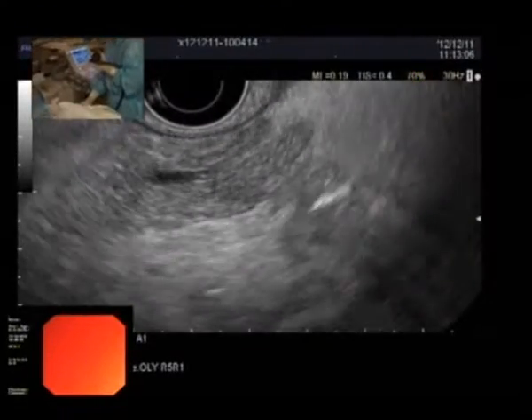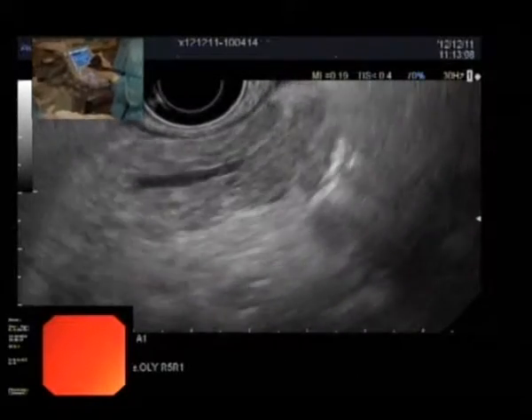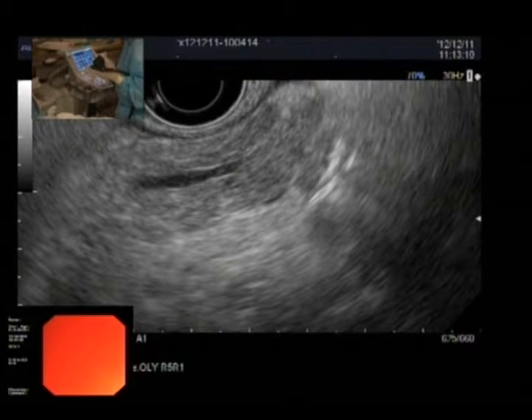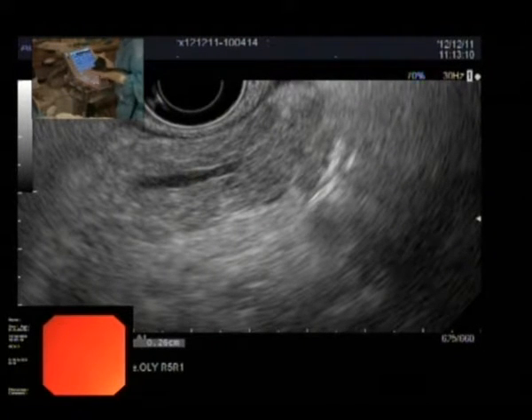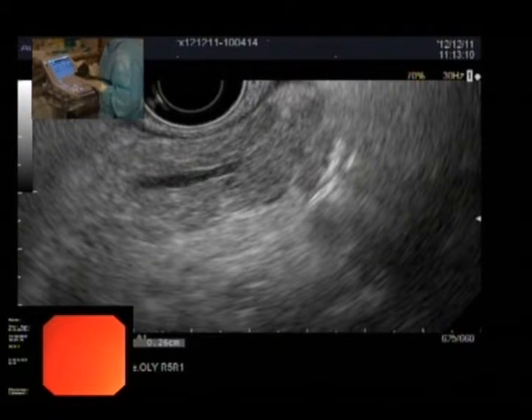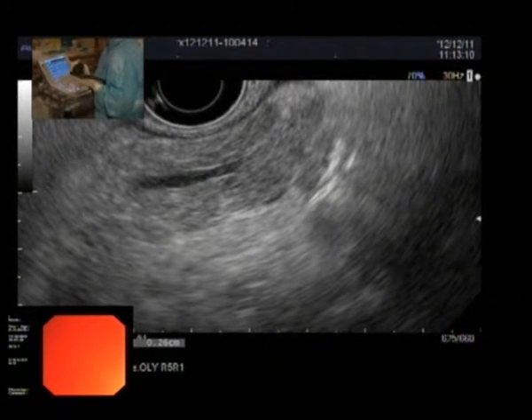And we can appreciate the main pancreatic duct. This is the size compared to her age. You think it's still too big for you? I'm measuring the size of the main pancreatic duct now. This is 2.6 millimeter. I think with senile change, this is within normal range, considering her age is 81.